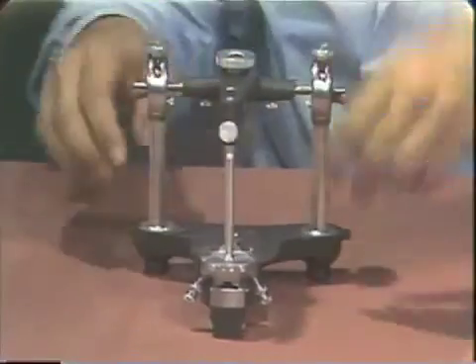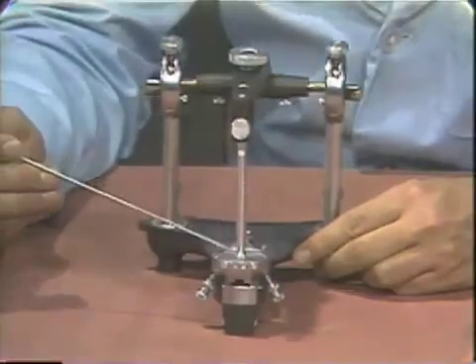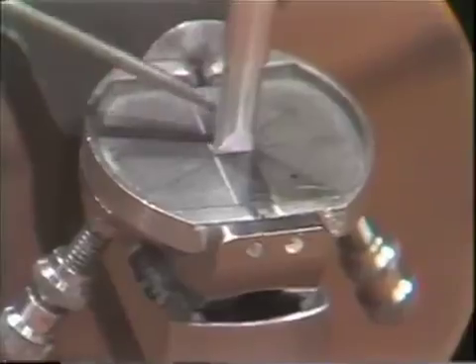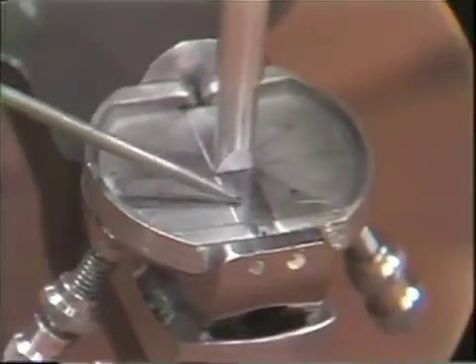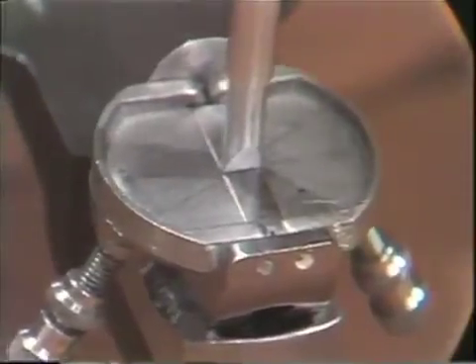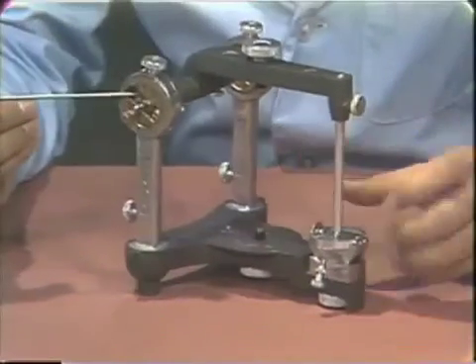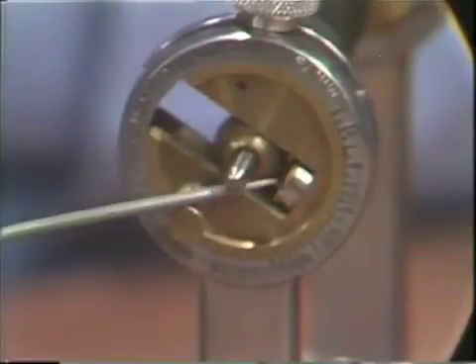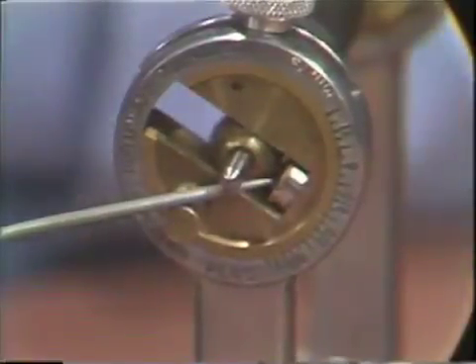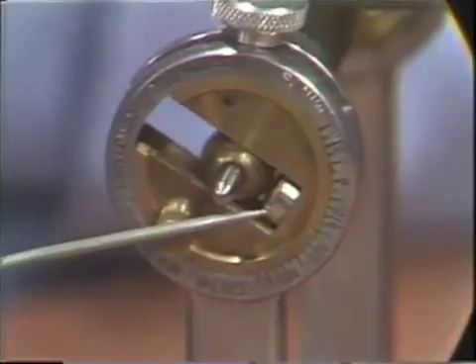The articulator is now centered antero-posteriorly, as evidenced by the positioning of the pin on the incisal guide table, and also centered laterally because the pin is on the central groove of the incisal guide table. In the condylar area, we are assured that the condylar ball is just touching the centric stop, and the centric stop is at the zero position on the protrusive-retrusive calibration.